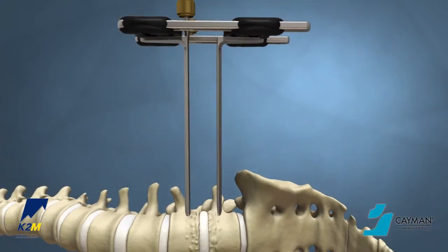This will eliminate the need to reposition the retractor when placing the Cayman MI plate following cage placement. Note that there are templates that can be used later in the procedure to individually reposition the retractor blades should placement of the blades closer to the end plates be preferred.